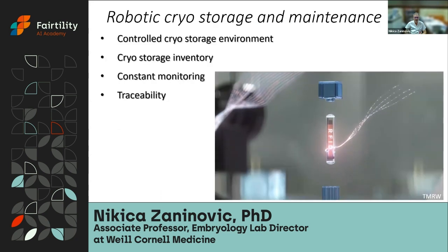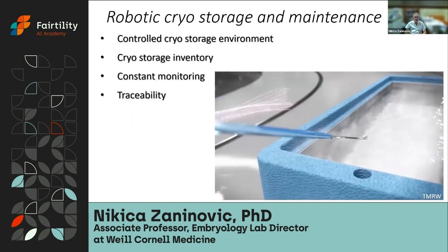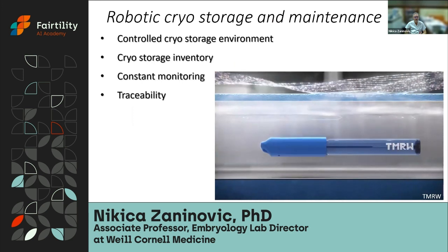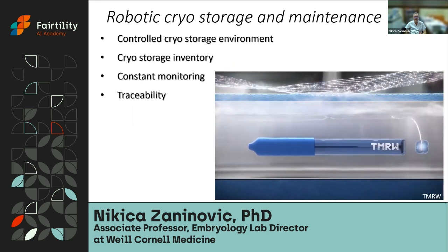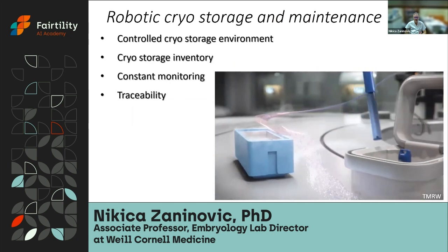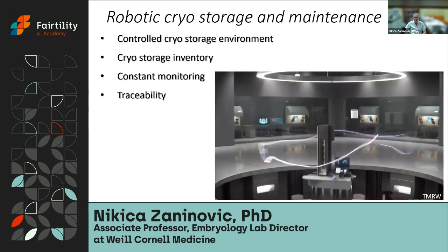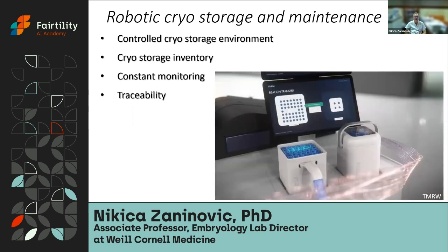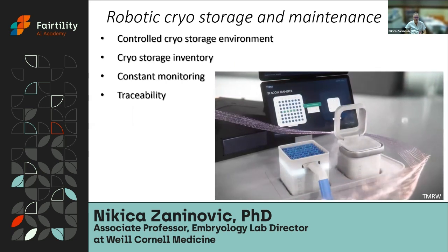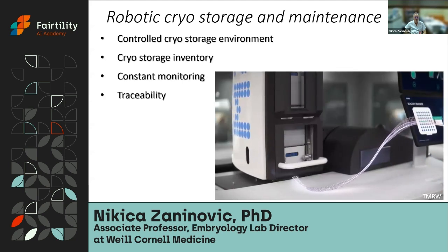It's already happening. We have a high level of embryos that are frozen, and the cryo storage has become a huge problem. We need to have a system that is going to give us a controlled environment. It's going to give us options that we have all the time. We have an inventory of the specimens. We can monitor these specimens all the time, and we know where they are. And there are already robotic systems on the market that we can use to achieve this, which will give us efficiency in the lab that is going to be much, much higher than what we are doing right now manually.